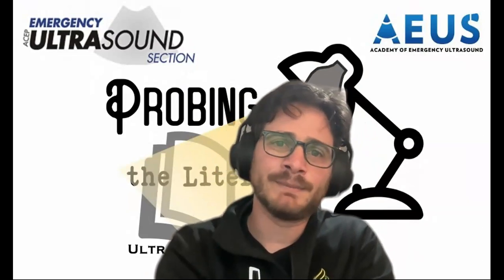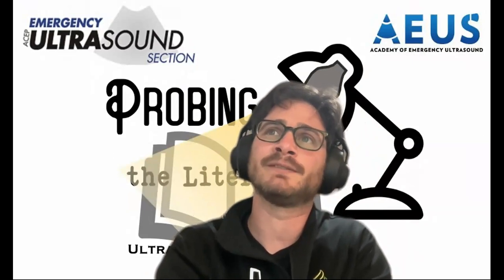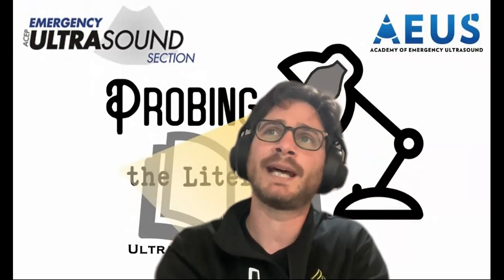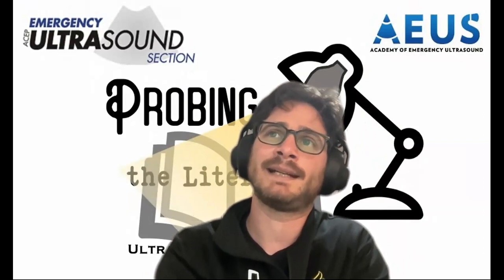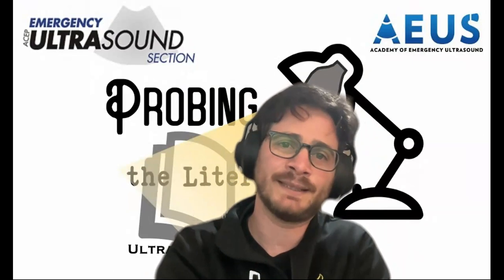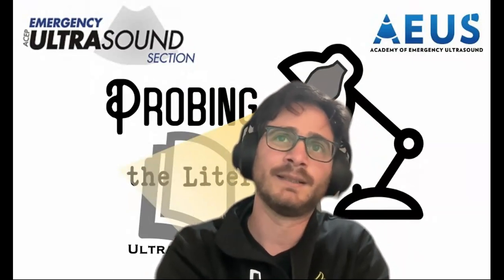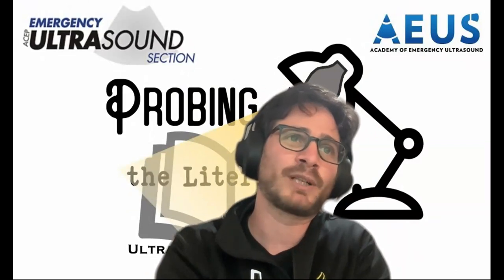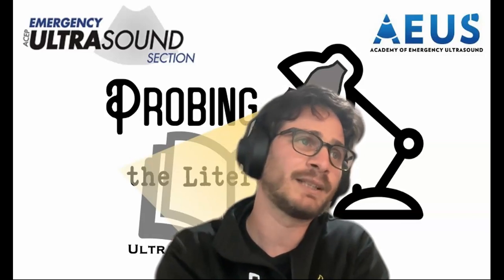One of the things for people to think about is these varying axes of the issues, right? One axis is how do you get it done in time? The other axis is who's doing that exam? Because if you're doing a point of care ultrasound study and you're not actually taking care of that patient, then how does that affect your results and generalizability?